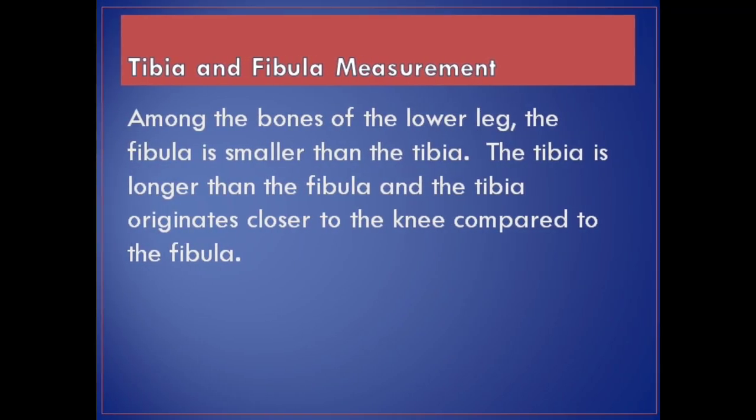Tibia and fibula measurement. Among the bones of the lower leg, the fibula is smaller than the tibia. The tibia is longer than the fibula and originates closer to the knee compared to the fibula.